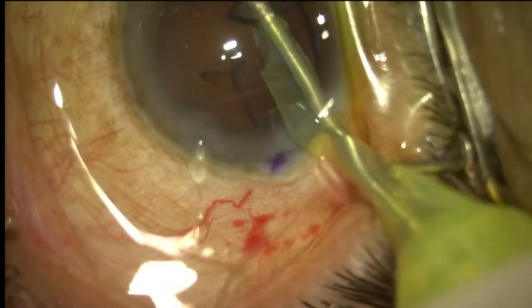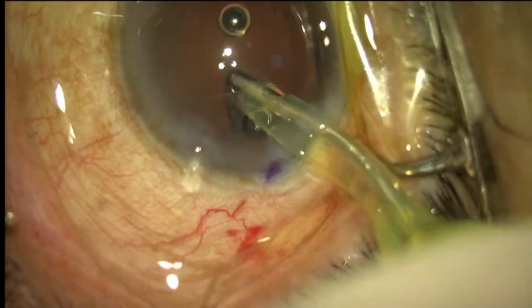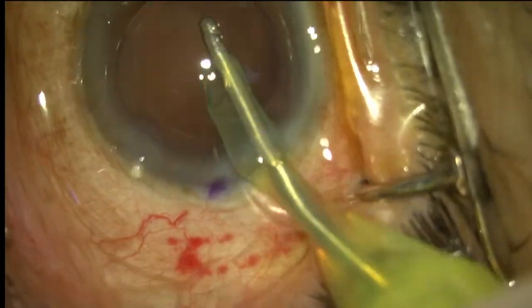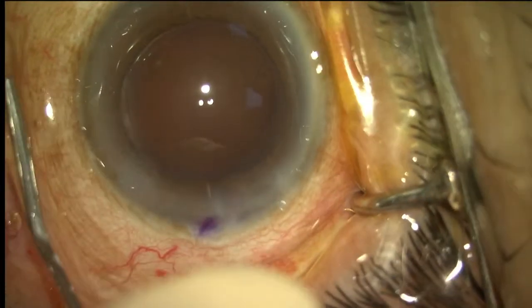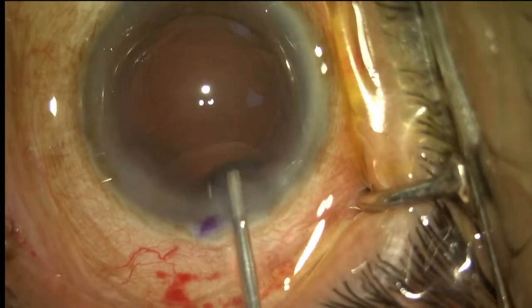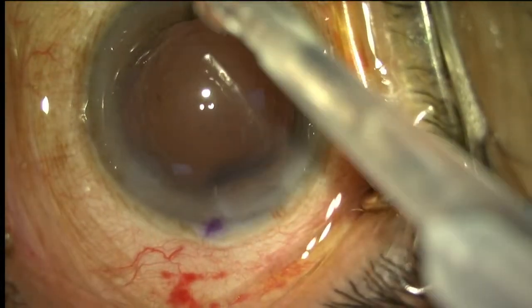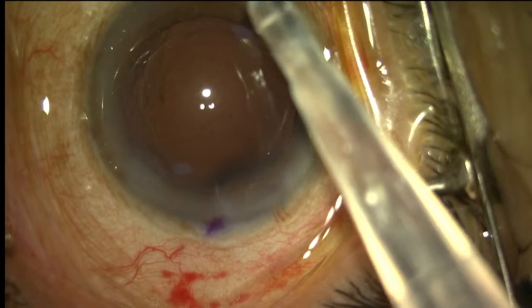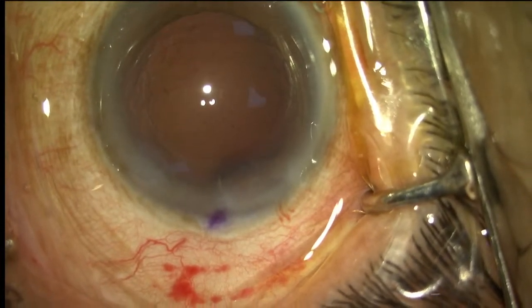Lens load. So here the cortex removal is complete. I always use the coaxial irrigation and aspiration cannula. And now I'll be showing you the implantation of the new Technis iHands toric, which is on the Toric 2 platform. Can somebody show the toric chart?